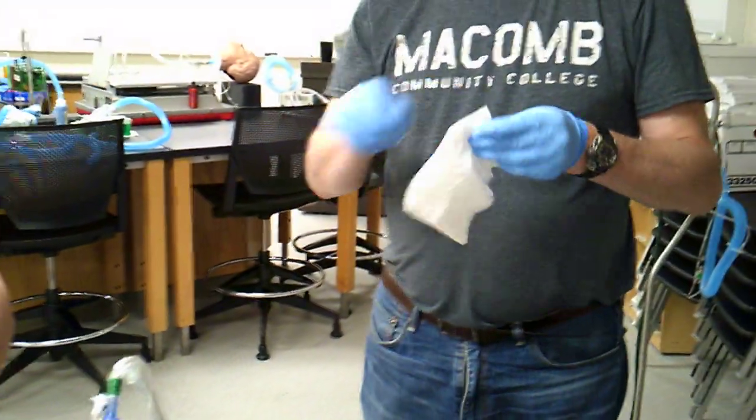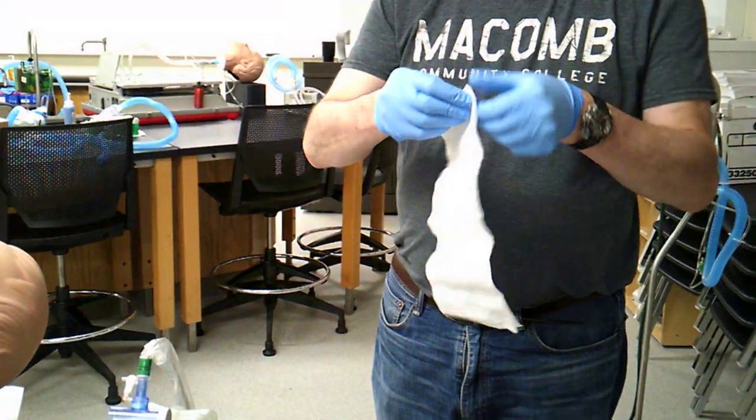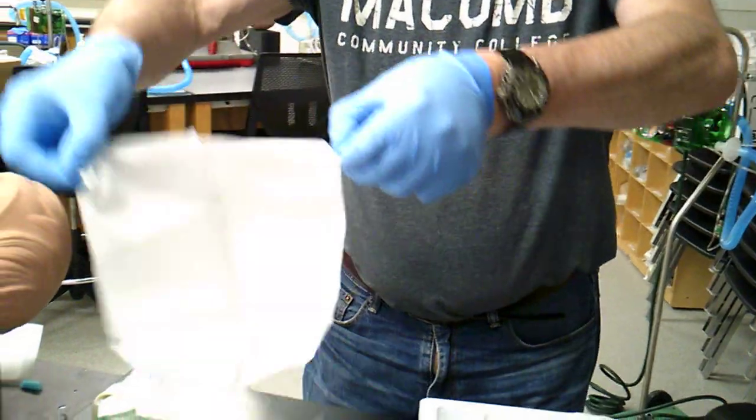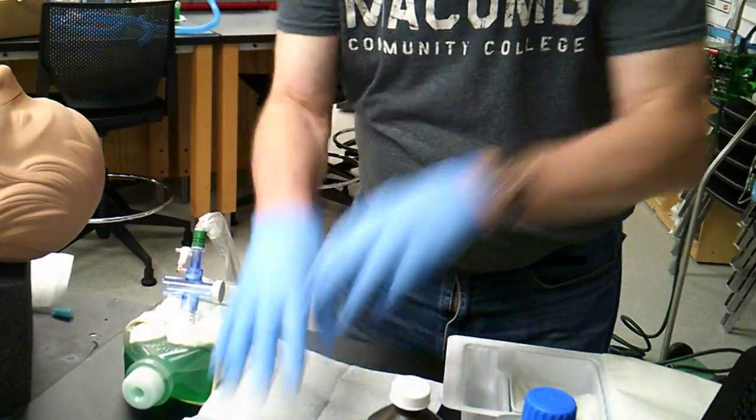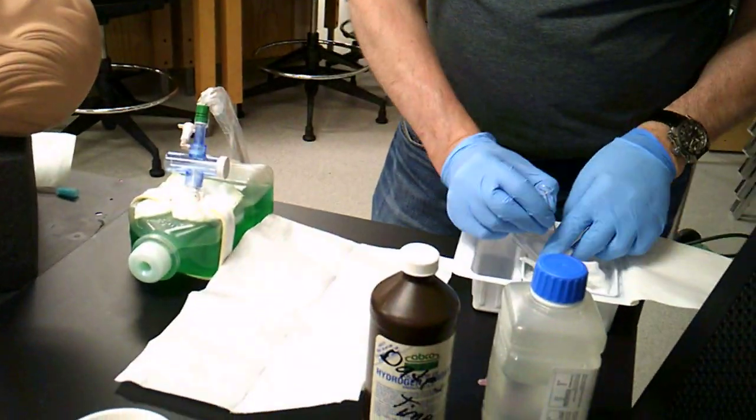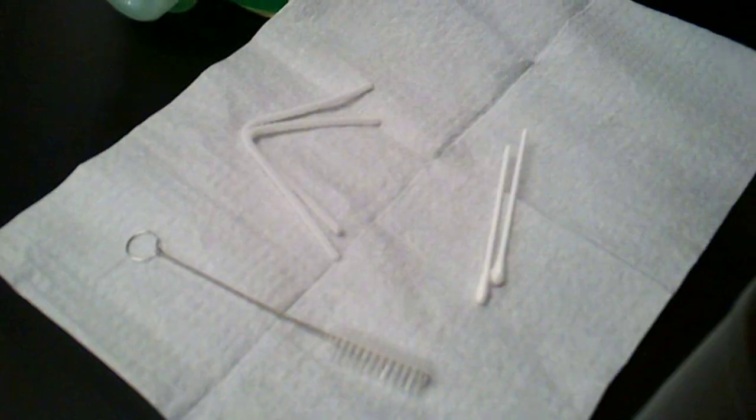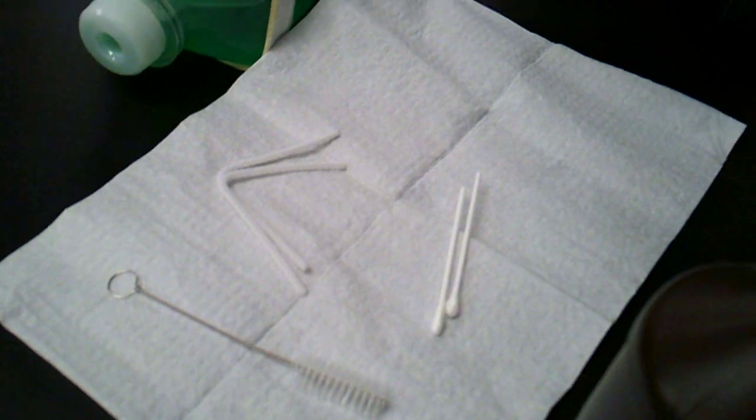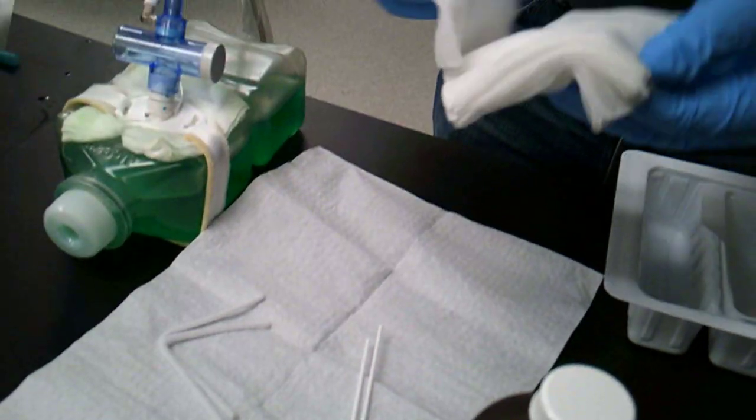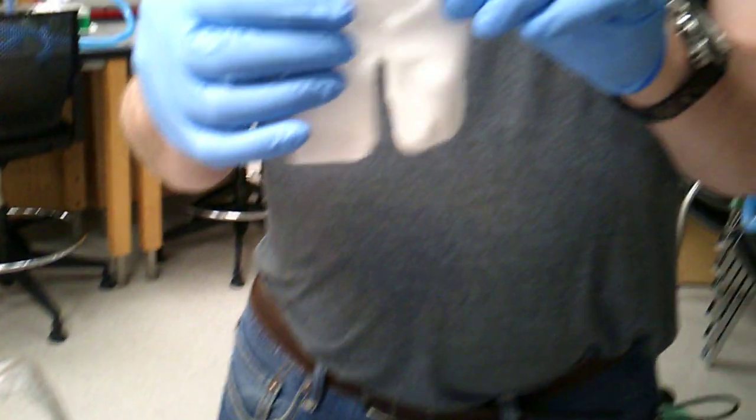I'm going to go ahead and open this up so I can put all my stuff onto my sterile dressing. So this is now sterile: brush, pipe cleaners, Q-tips, and gauze pads.